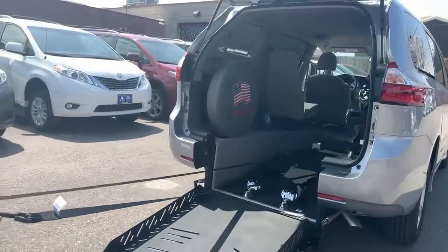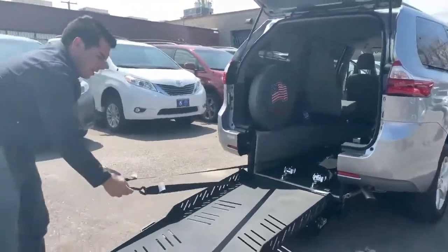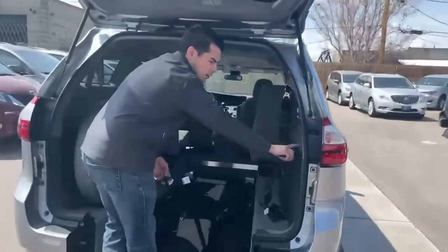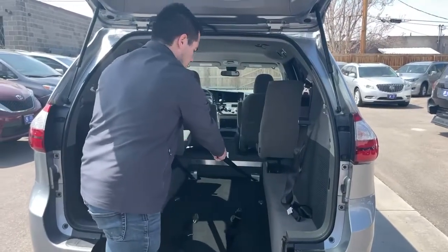And then you would have the wheelchair sitting right here. Then we're going to hook those onto the wheelchair. And we're actually going to hit this button here again, down, to lock. So when it's locked, they won't come further forward — they'll keep retracting inward.